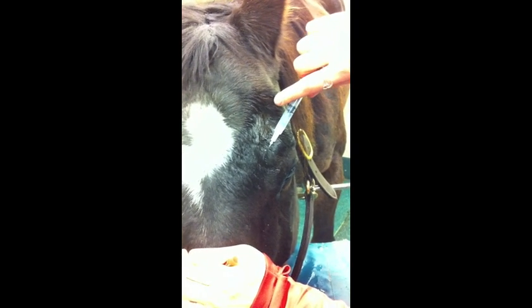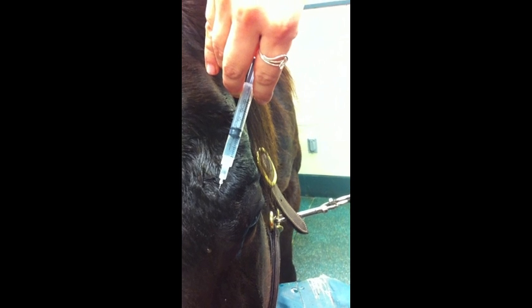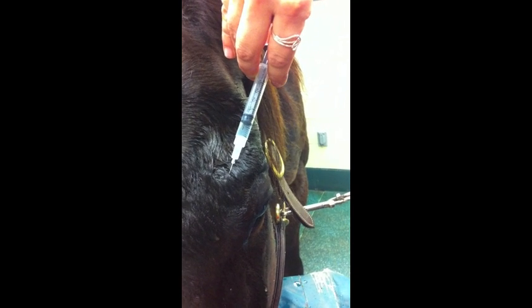Always aspirate, and I'm just going to go ahead. Oh, kiddo, I know it stings. Back some out a little bit. That should work. Always worthwhile, just massaging that around. Make sure you get good penetration.